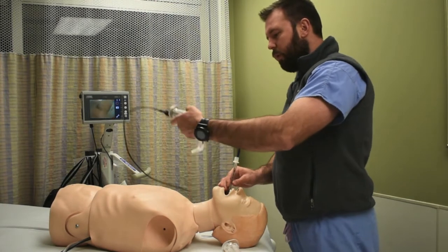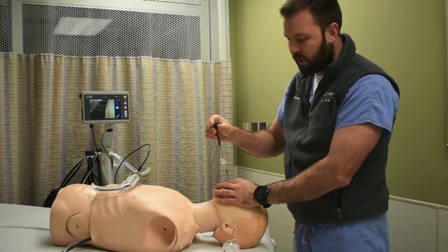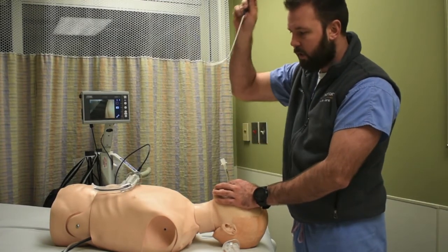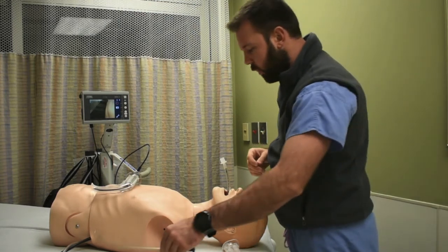Now, when you go to remove either the blade, but especially the stylet, we need to remove this pulling it down towards the patient's foot. That way the curve of the hyperangulation doesn't come straight out. It could actually damage the tube or sometimes pull the tube out from the vocal cords.